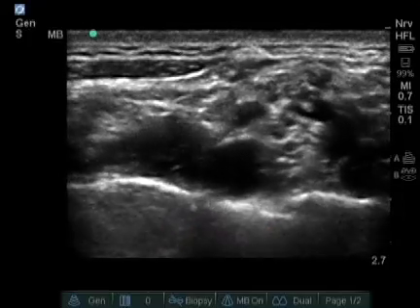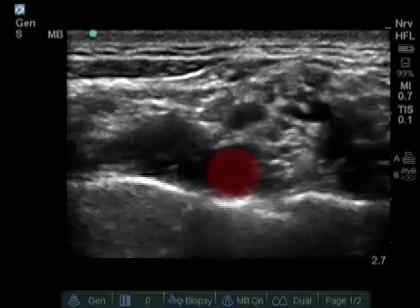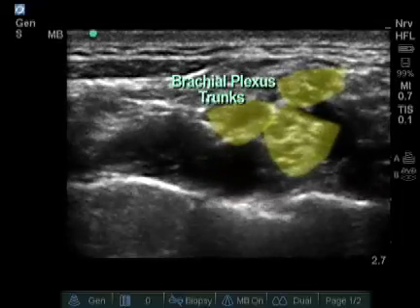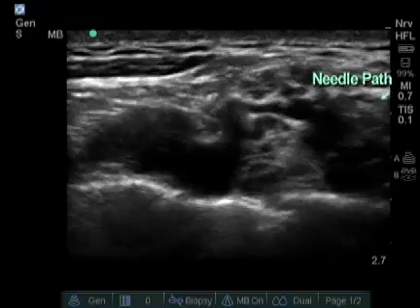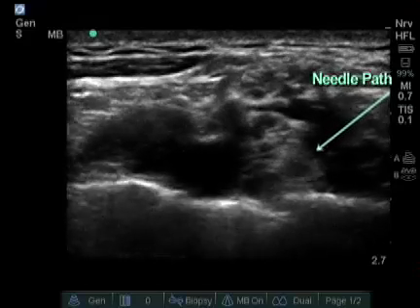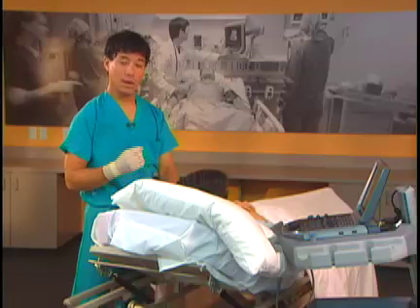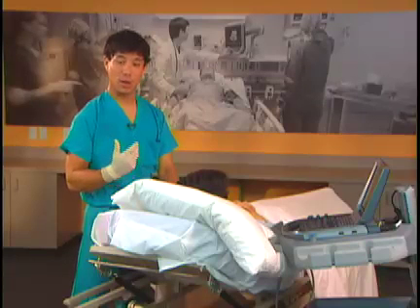On the screen we now see from left to right the anterior scalene on the left and the pulsating subclavian artery. The most important place to make sure you have local anesthetic is between the pulsating subclavian artery and the first rib, because the inferior trunk lies in this area, and some people have difficulty with the supraclavicular block because it is ulnar sparing.